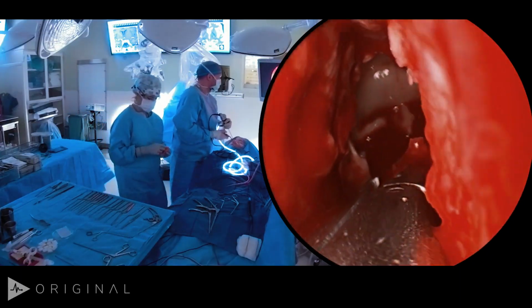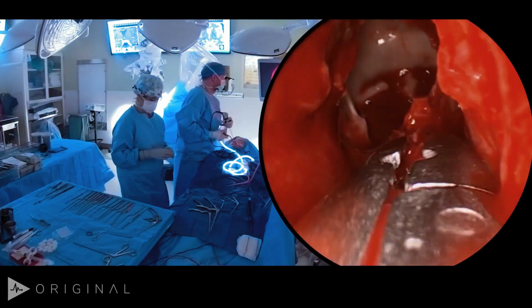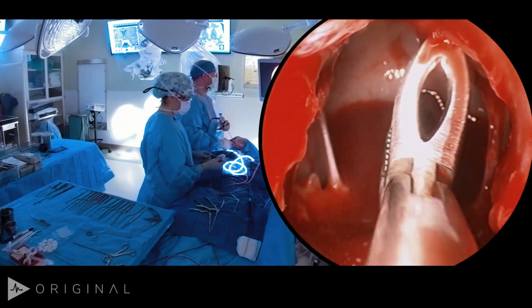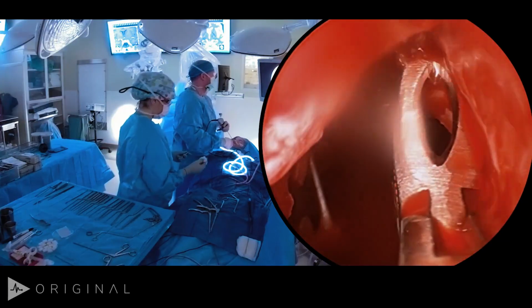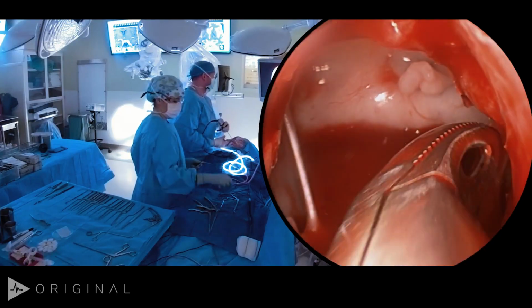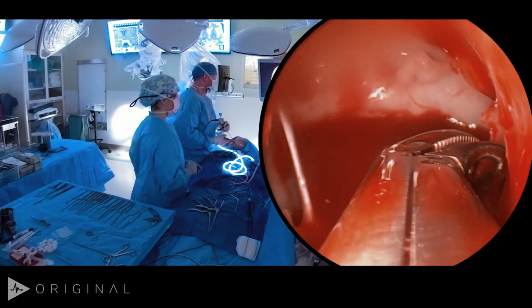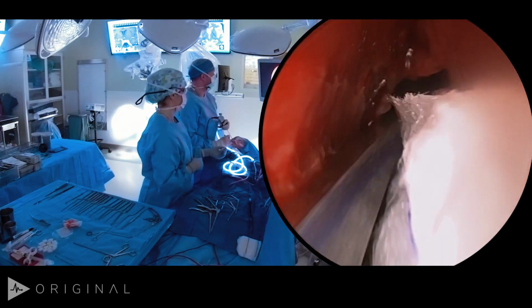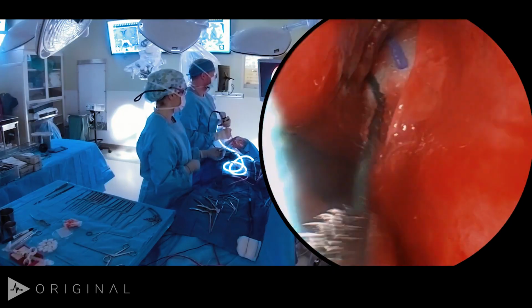This is a Takahashi that I'm using to try to get a little more of this sphenoid rostrum off. So now I'm going to try to use a 45-degree through cut just to see if I can get a little bit more of this down out of our way. We're very close to being where we need to be at the moment. And again, I'm just taking little bites of this intersphenoid septum because I don't want to take a big bite or avulse it. So before we take one last look before bringing the speculum and the microscope in, I'm just going to put these pledgets in to dry things up.